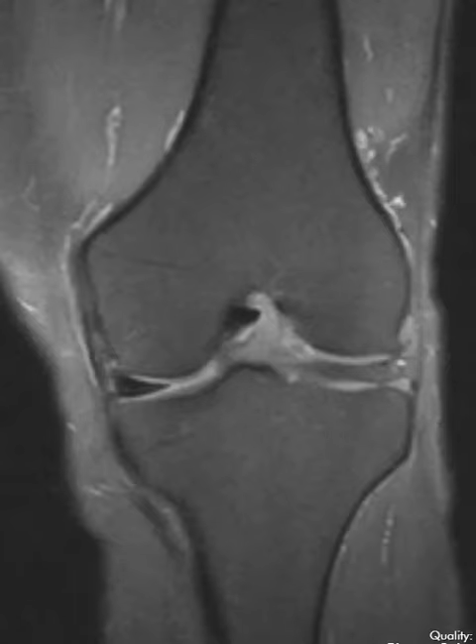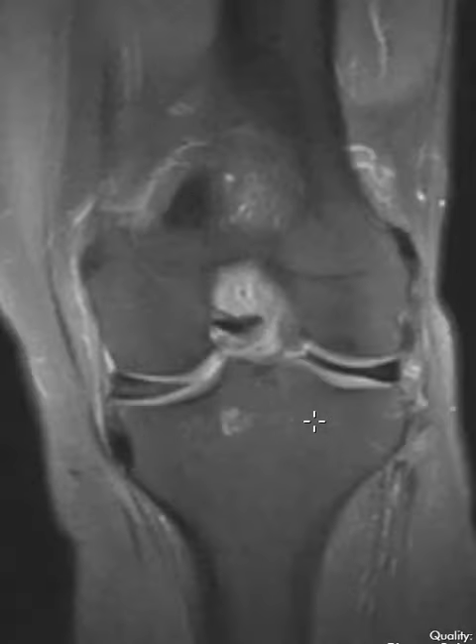Now the lateral meniscus should look just like this, but instead it is this broad disc-appearing meniscus. It looks like a big broad disc and the inner margin, instead of being pointy, is just as thick as the outer side. It's abnormally thick and again abnormally broad.